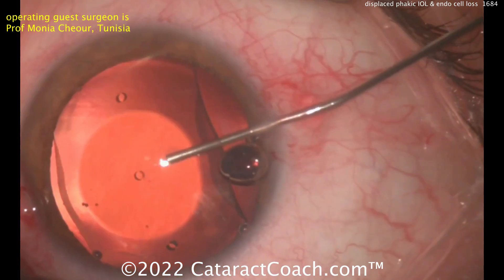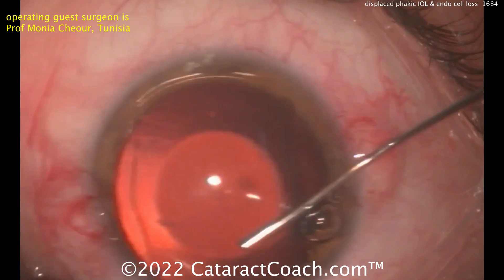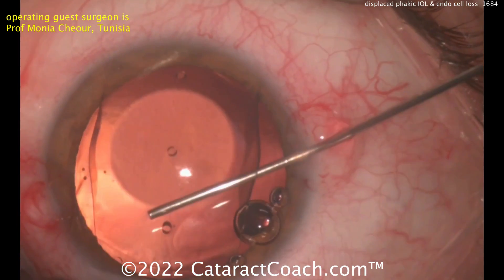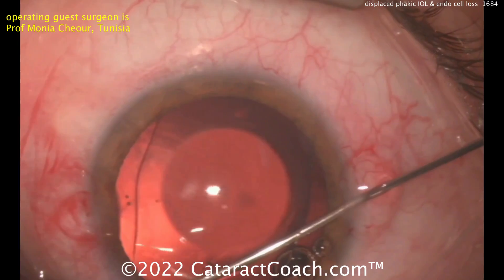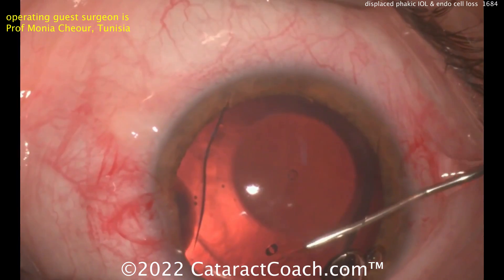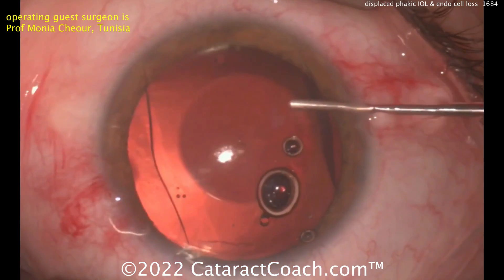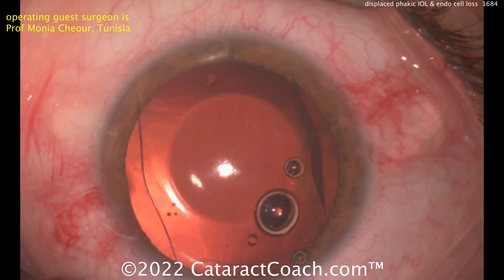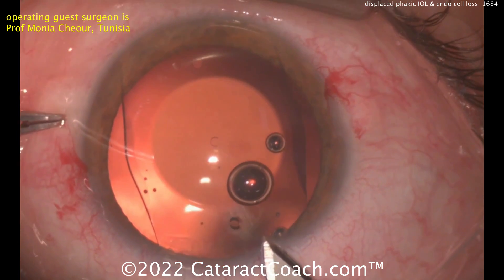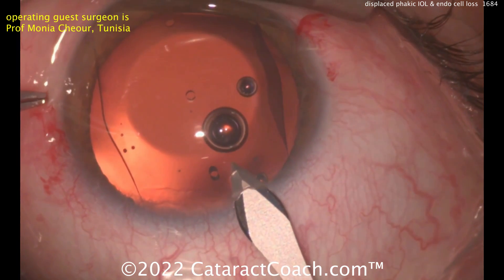Remember, on a young patient like this, you want that endothelium to last the patient's lifetime — you don't want to have to do a DSAEK or DMEK down the road. Getting that lens out of position, out of the sulcus space — and you can see this lens has a hole in the center of the optic so fluid can flow through it. These phakic IOLs can be great products and do very well for patients, like the patient's other eye.